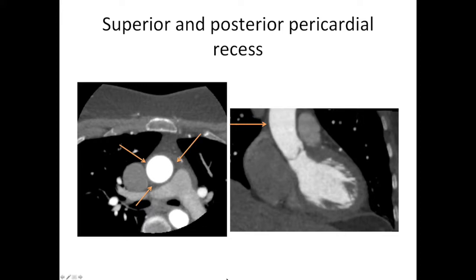The superior pericardial recess we can split into anterior and right components. This first arrow here is the anterior superior pericardial recess. Over here we have the right superior pericardial recess, and back here we have the posterior pericardial recess. On this image, there's just a little structure in here — now this isn't the superior vena cava, this is the right superior pericardial recess. You can tell it's actually separated from the heart, and that this is the atrium that's separate to it, rather than if it were the superior vena cava, it would be connected.